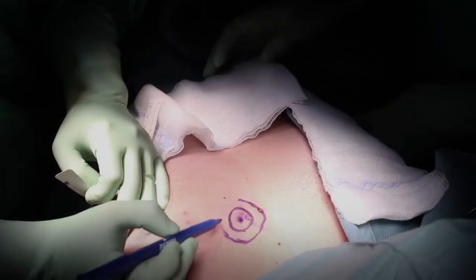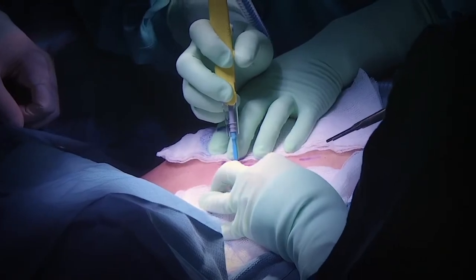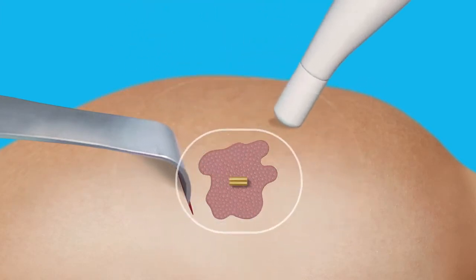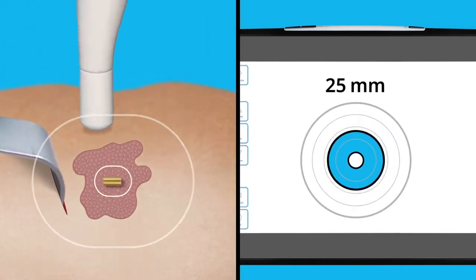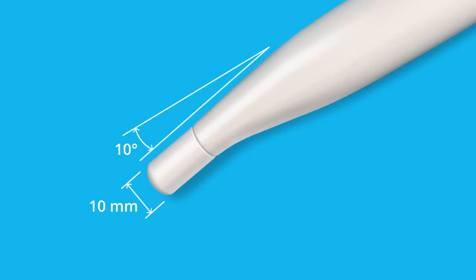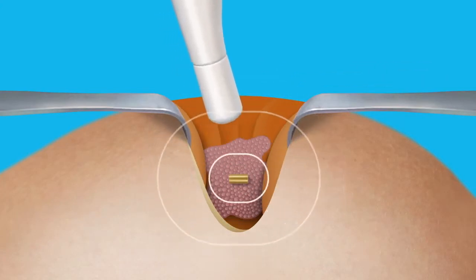The surgeon begins to excise the tumor. The magnetic MOLLE marker is easily located by the MOLLE wand while using standard metal instruments and operating equipment. Throughout the procedure, the surgeon dynamically uses the MOLLE wand to verify the location of the magnetic MOLLE marker in real time. The streamlined 10-millimeter tip and 10-degree curve of the MOLLE wand help access and work in tight surgical cavities.